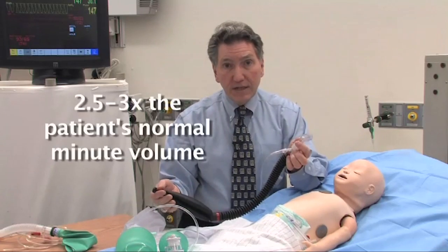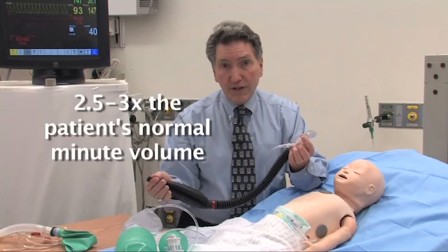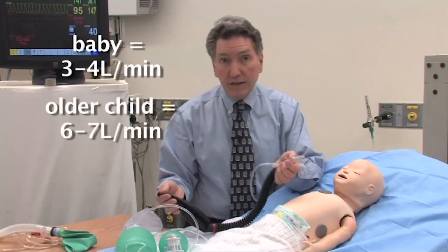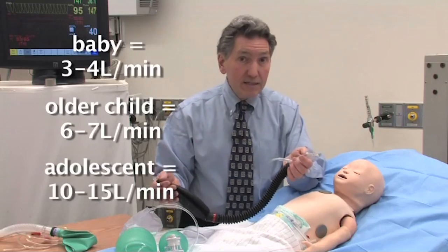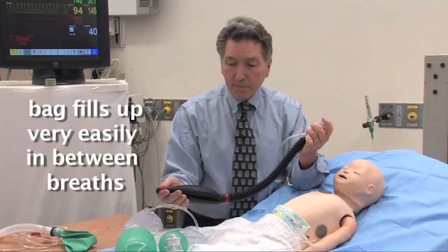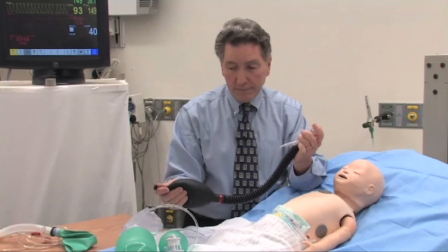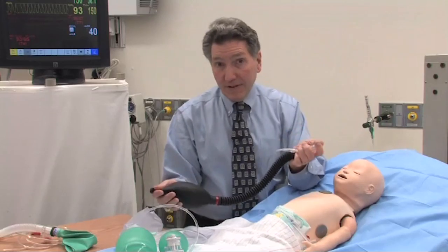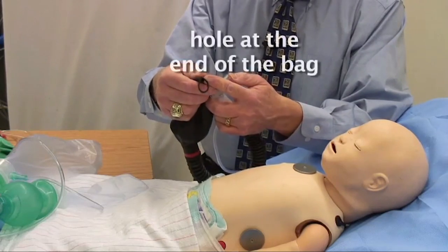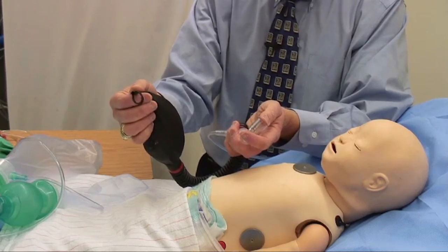Typically you want about two and a half to three times the patient's normal minute volume as a reference for fresh gas flow. For a baby, that'll be around three or four liters a minute; for an older child, six or seven liters a minute; for an adolescent, 10 or 15 liters a minute — enough so the bag fills up easily in between breaths and you are flushing the system and getting rid of CO2. In this system, the 'valve' is really the hole at the end of the bag, which I squeeze with my fingers to generate the effect of a valve, PEEP, and CPAP.